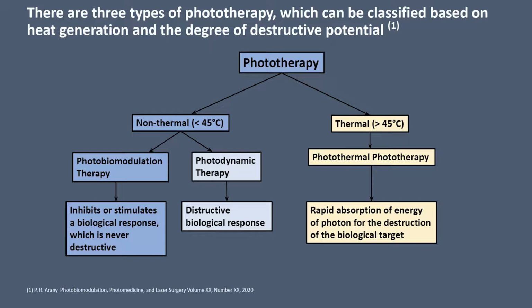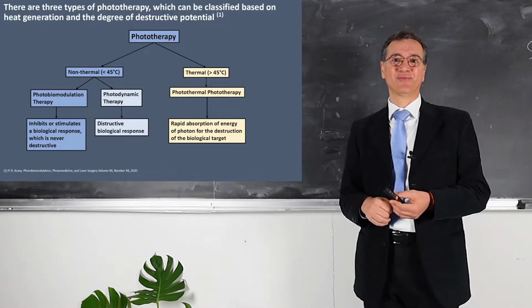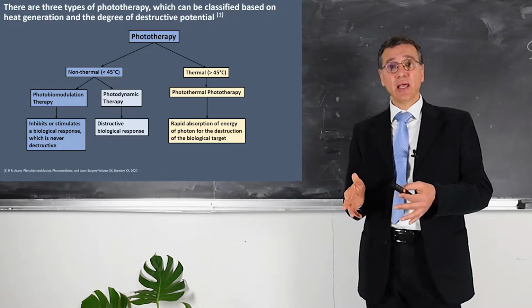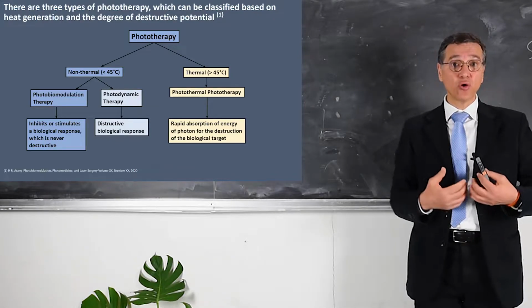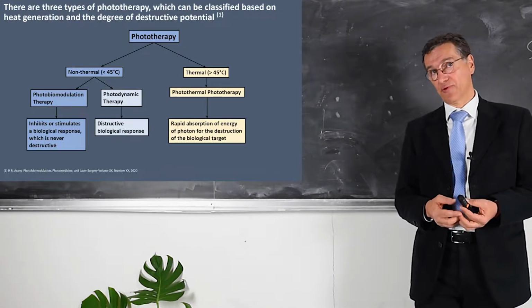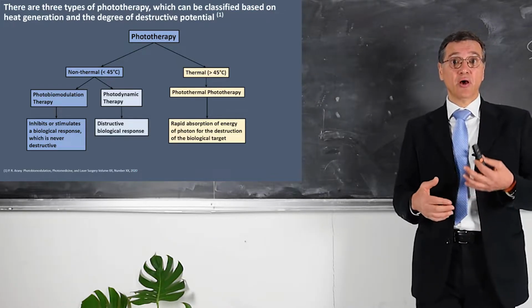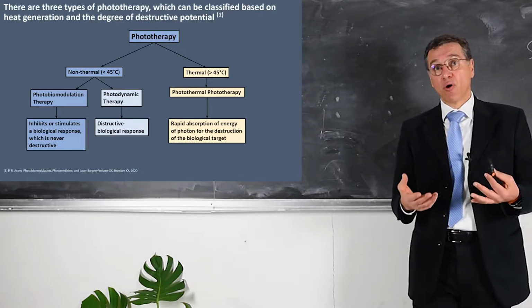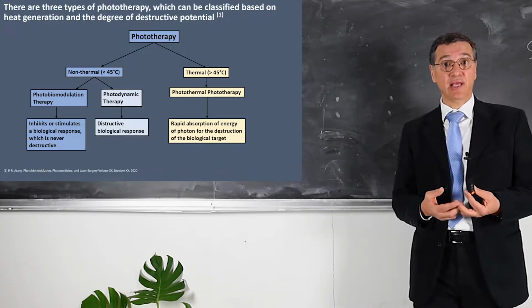Here, because the photons are interacting with the chromophores, they are creating some photochemical effects, which are healing or killing the tissue. The other one is the interaction of photons with endogenous, naturally present chromophores. And again, here we have a photochemical effect whose components activate cell pathways which produce healing processes.